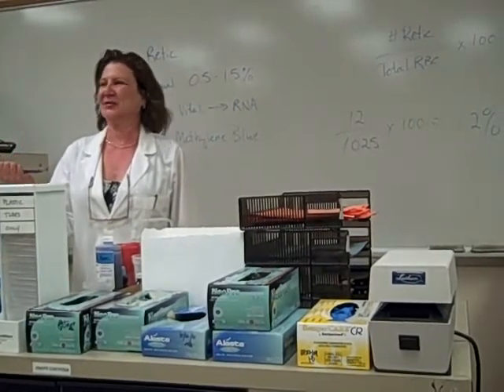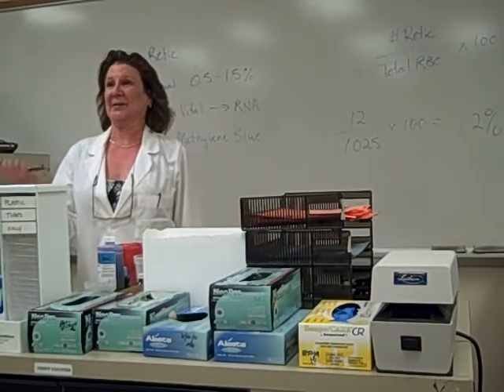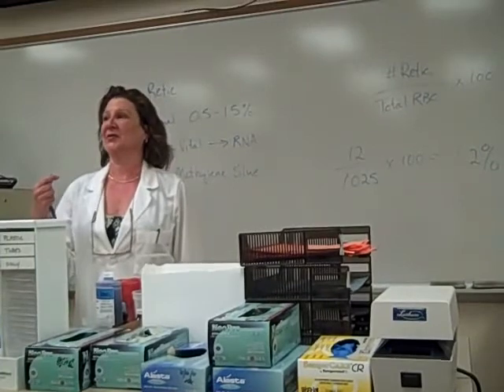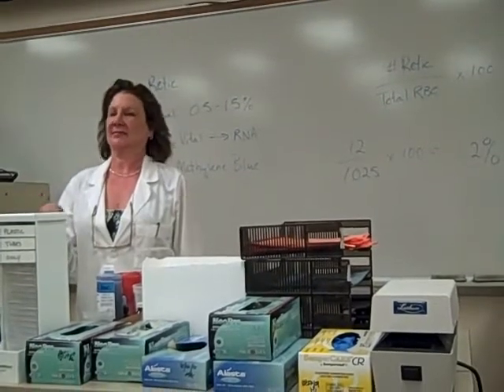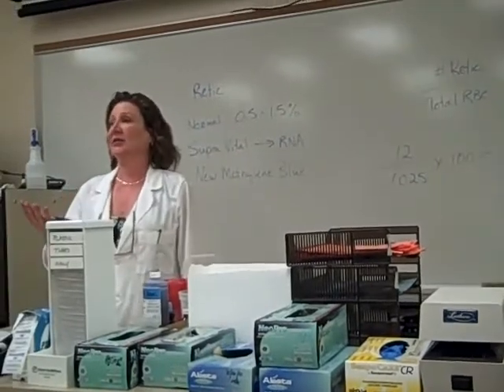In a few minutes we'll sit down at the scope and I'll show you Dorothy, who was actually one of my students' grandmothers that went in the hospital. She had a lot of blood loss. Her retic count is about 20%, so it's awesome to look at. So we'll look at that together and I'll show you what a retic looks like.